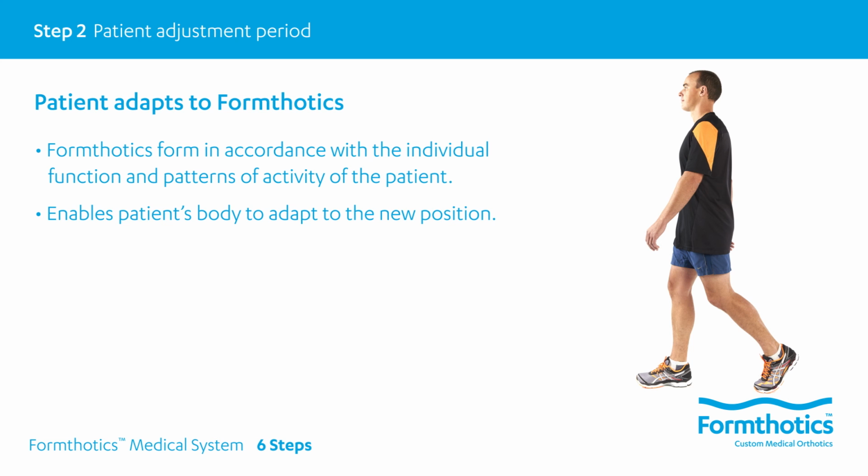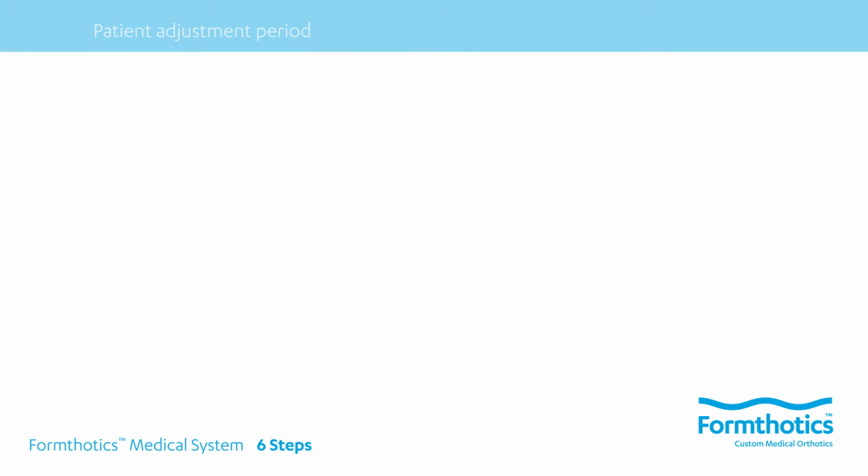This is particularly important when the patient is wearing Formthotics for the first time. The adjustment process also ensures the Formthotics mold properly to the undersurface of the foot. This means the practitioner can visually assess what postings are required where when the patient returns for their follow-up appointment. During this period, typically 3 to 7 days, there is increasing time and activity wearing Formthotics.